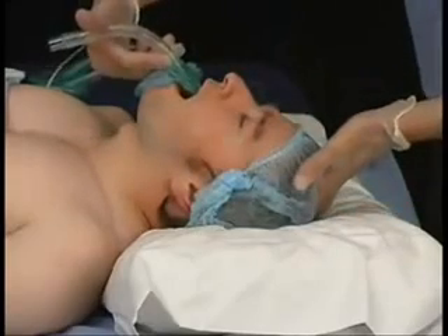We are ready now to start inserting the laryngeal mask airway. And there you see it — following the natural curvature with the finger going as far as it can, and then using the other hand to stabilise the laryngeal mask as you remove the introducing finger.